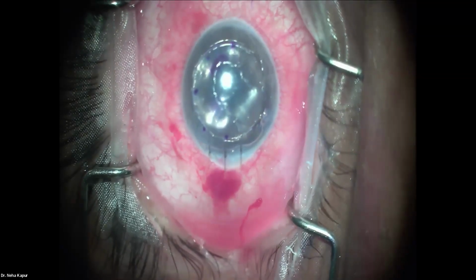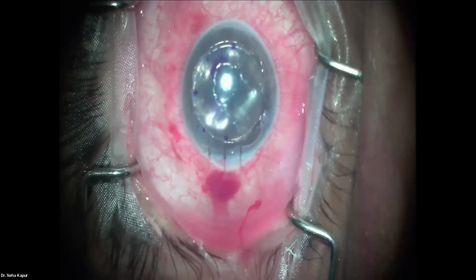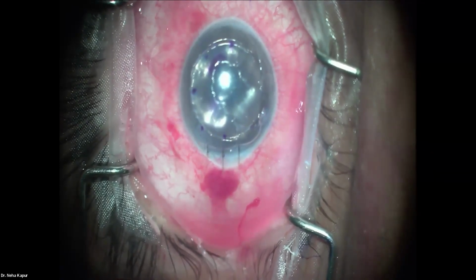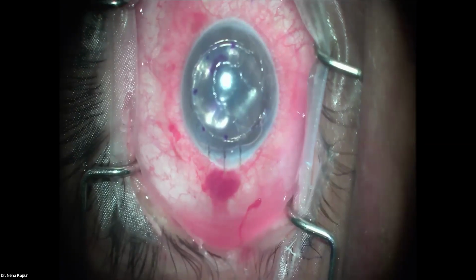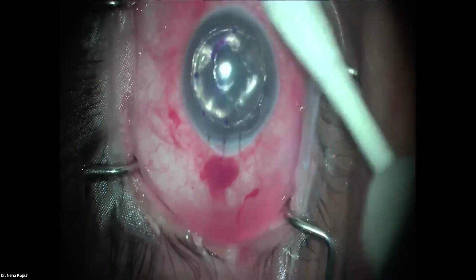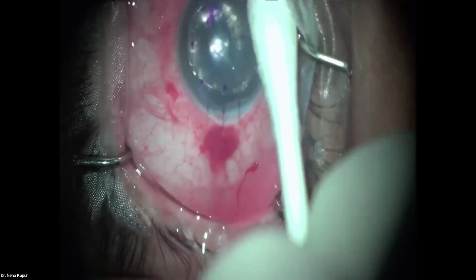The next question is, what are the signs of DSAEK graft rejection? You can typically see endothelial rejection in these patients. You will start seeing some pigment or keratic precipitates on the endothelium. The patient may come with stromal edema or a drop in vision. Looking for the endothelial rejection line becomes important in these patients. Usually the rejection rate is very low in endothelial keratoplasty in comparison to penetrating keratoplasty.